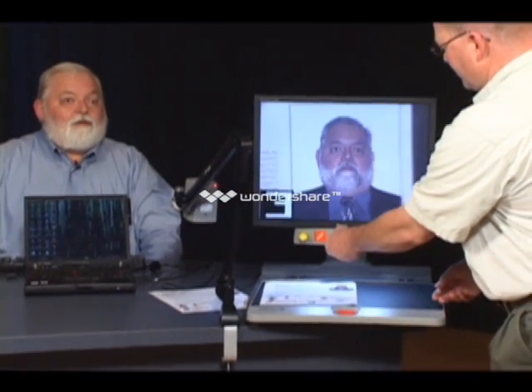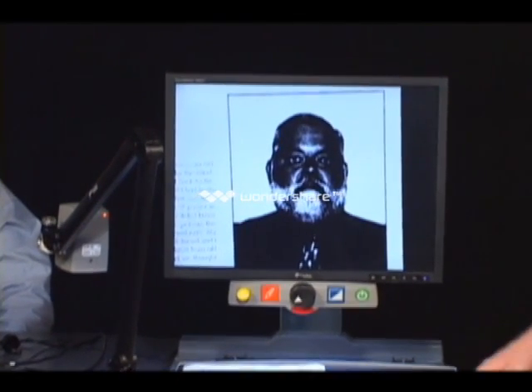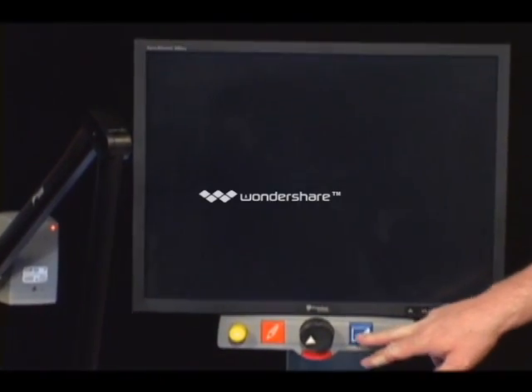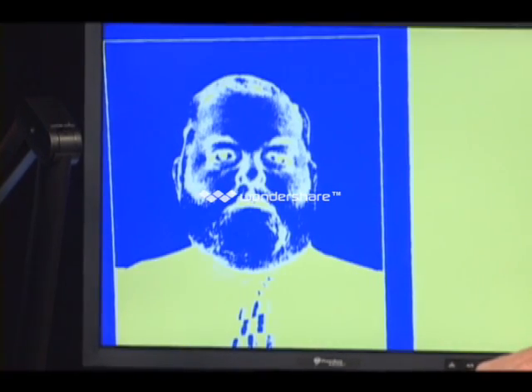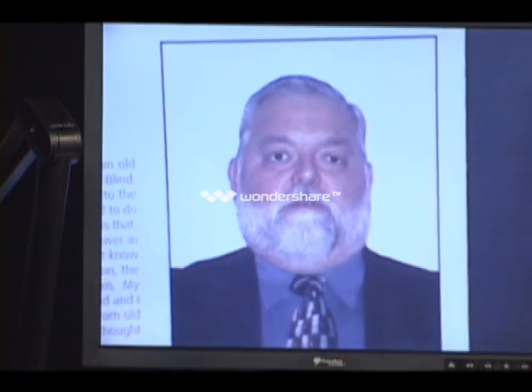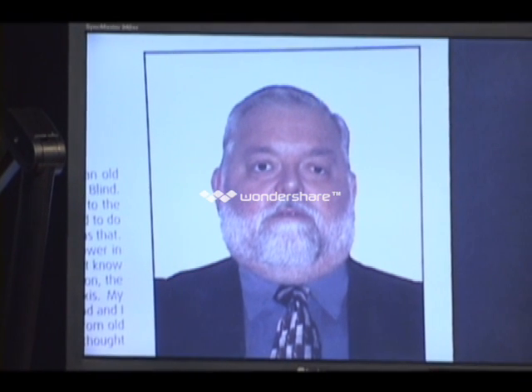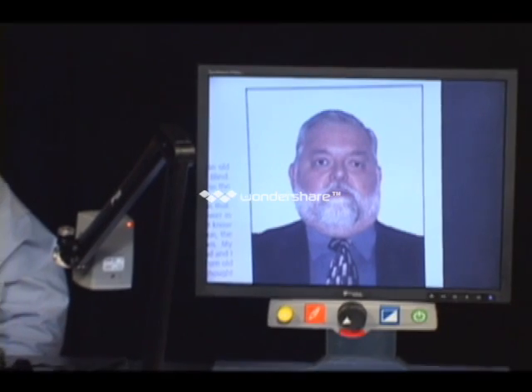We'll crank it down a little bit more. Okay. There's the high res. Okay, now go to white on black. That doesn't look too good. Go to the next one. That's even worse. So you got to watch it when you're looking at pictures with this. You really want to look at full color. And full color is important for a couple of reasons. Even if you prefer to read with just black print on a white background, there are many things nowadays where color matters. There's maps.